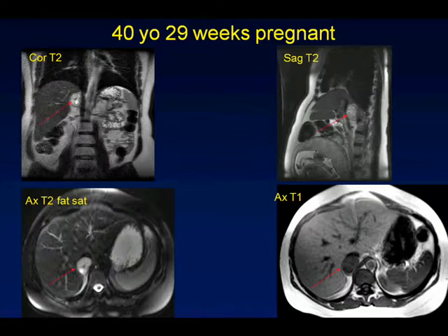Gadolinium if contrast was given. Occasionally calcification can be quite bright. So as you see on the T1, it's not typical for a hematoma, which they might have suspected based on her treatment of anticoagulation. But on further history, she actually had hypertension, which was long-standing. She actually had a 20-year history of hypertension in a 40-year-old patient. So we suspected it was probably a pheochromocytoma.